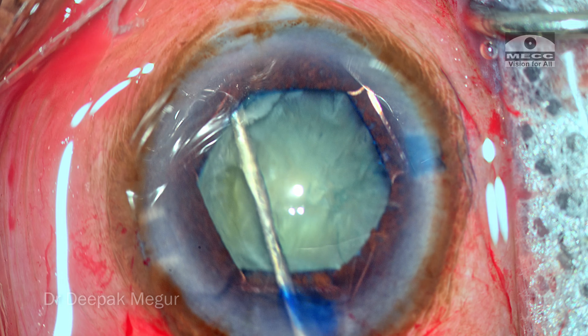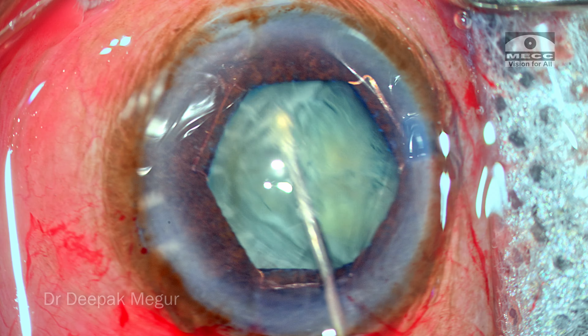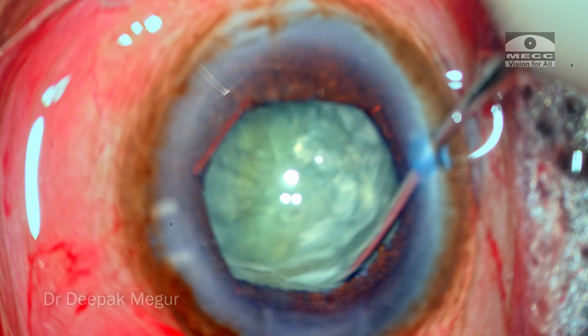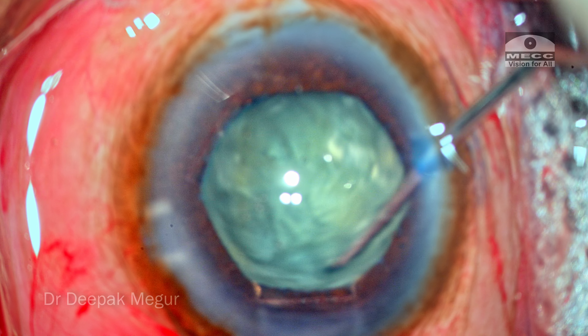Rhexis is completed — it's about 5.5 mm, not an issue. Hydrodissection is done. The nucleus rotation is confirmed and we can see that the nucleus is very freely mobile. There's no evidence of any zonular weakness until now.